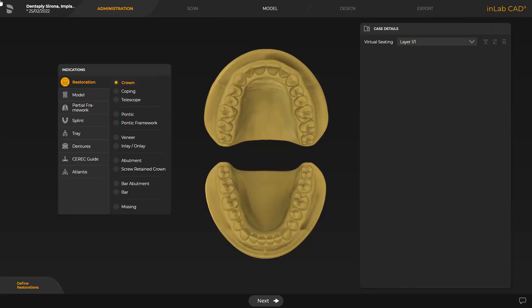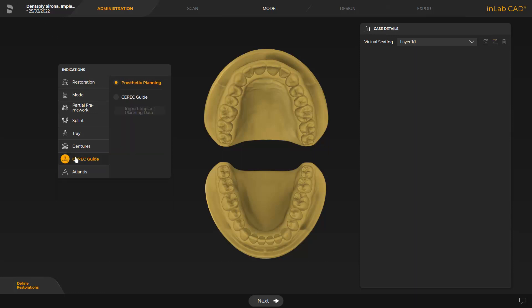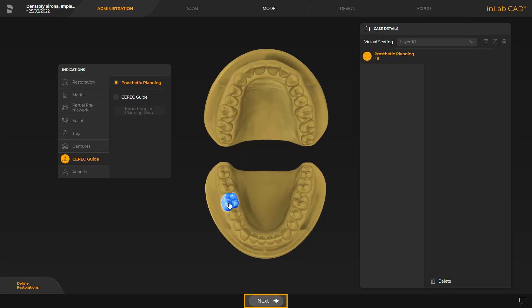We start in the administration phase and select the indication CEREC guide. Next, we click the appropriate tooth position in the odontogram to administrate a prosthetic planning element. Since these are oral scan data, we move to the next available phase, the model phase.